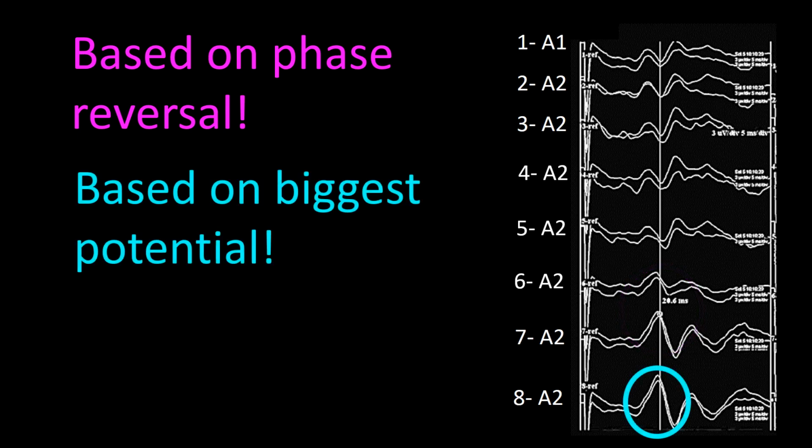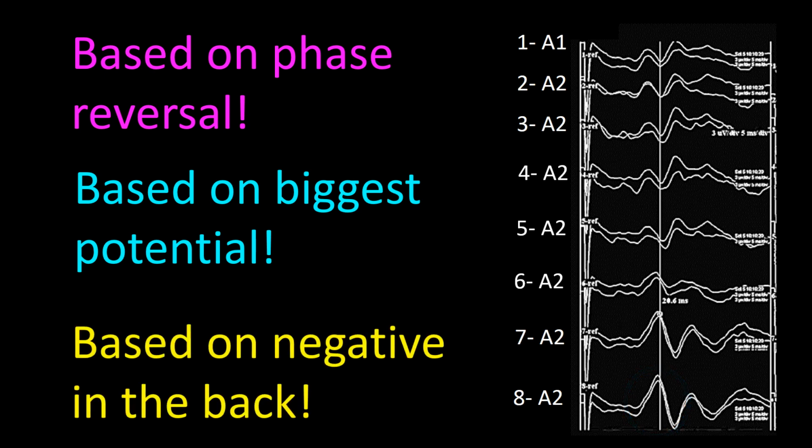The highest potential, another criteria used to find the central sulcus, is at the end of the chain, raising the possibility that an even higher potential could be present after the 8th electrode. The only clear criteria in this montage that is met for the selection of the central sulcus is that the negative potentials are in the posterior derivations.